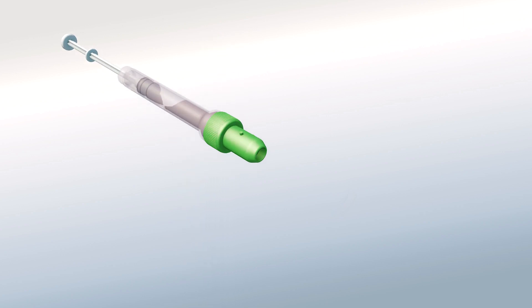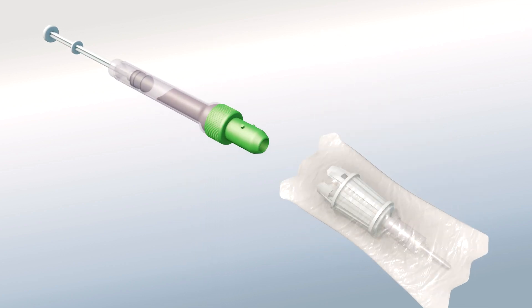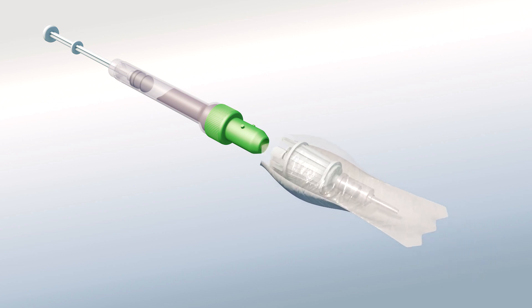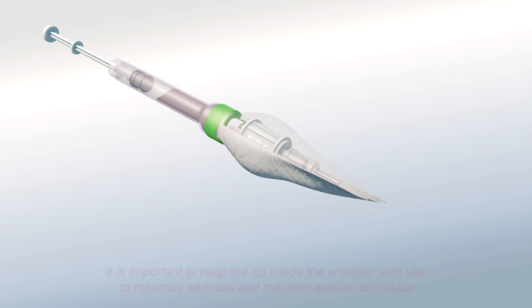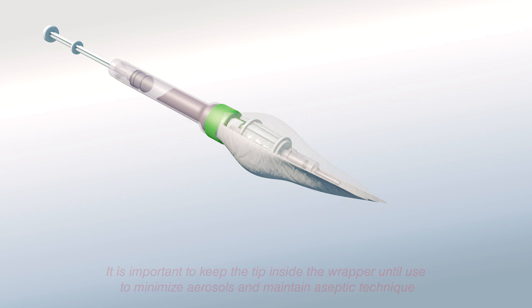Next, remove only the holder portion of the blunt tip adapter and attach it to the tube by the cap with two fingers, turning it slightly to the right. It's important to keep the tip inside the wrapper until use to minimize aerosols and maintain aseptic technique.